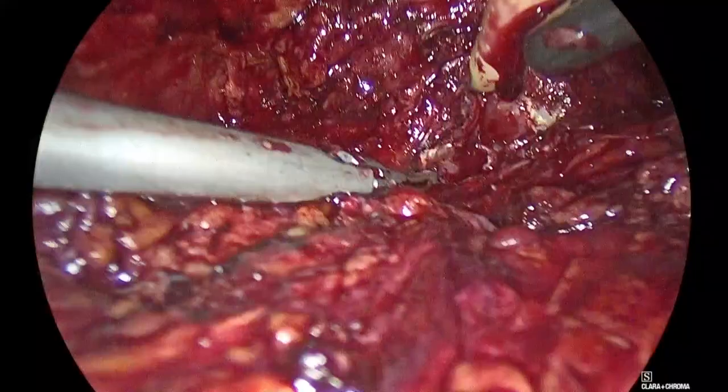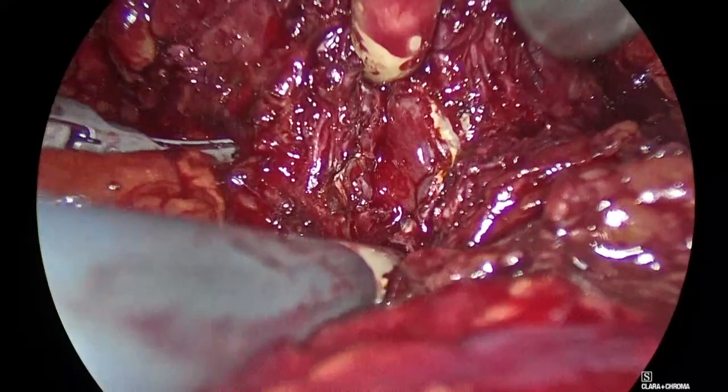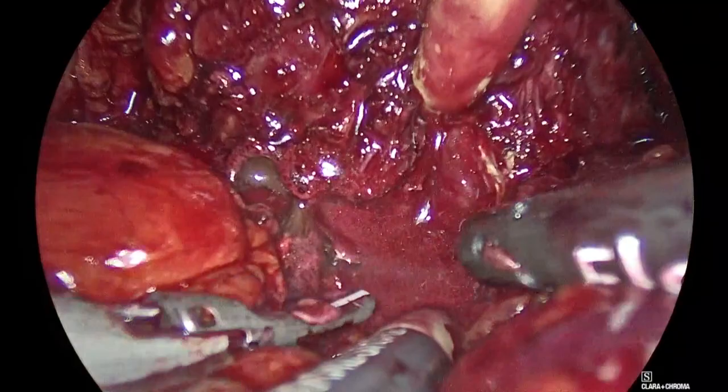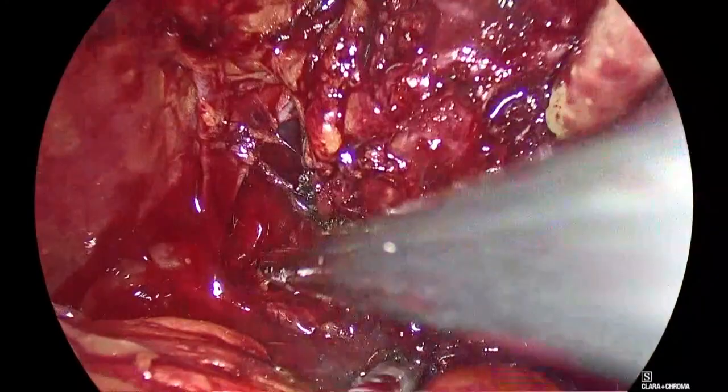Sack, Panagioti. You see, this is clearly bladder neck. Prostate is here, so I can safely go here. Aspirate inside, Panagioti. Good. Quite a bleedy thing, eh? Let's see if we can do some hemostasis here. Where is it bleeding from, Panagioti? Show me. Left side, Padeli.